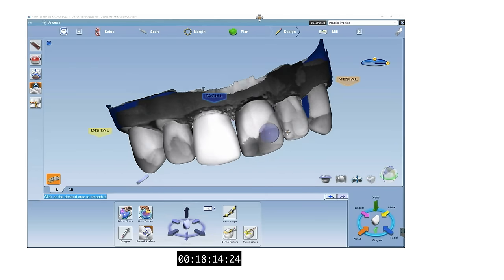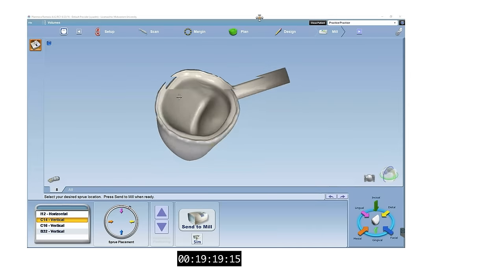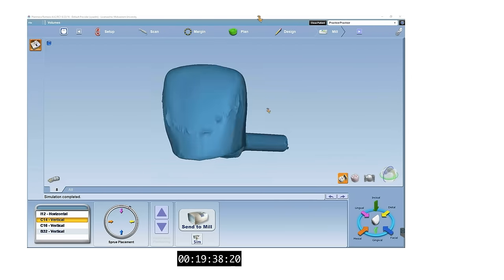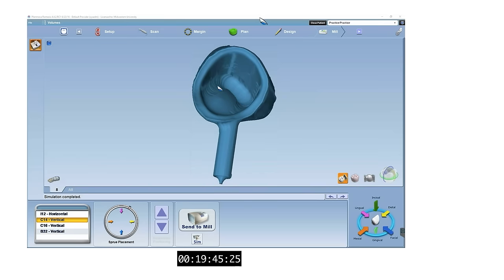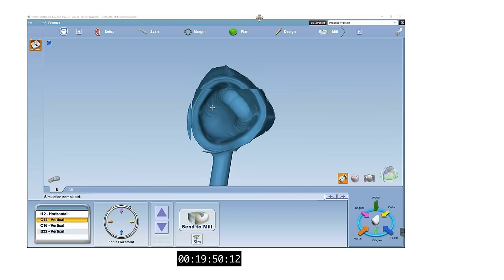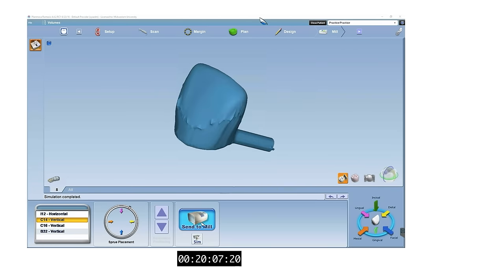Once the final details have been made to the crown, the location of the sprue can be decided. Avoid placing the sprue on the facial and proximal surfaces. Next, compare the proposed crown with the milled simulation. This simulation takes into account the milling limitations of the mill's burrs. You can see that the mill will have difficulty milling the incisal portion of the intaglio surface — the crown will likely require adjustments before properly seating. A smooth prep with rounded corners will avoid this issue.